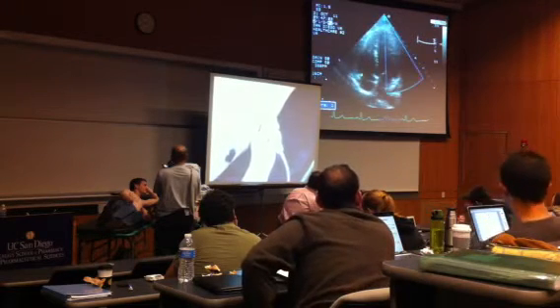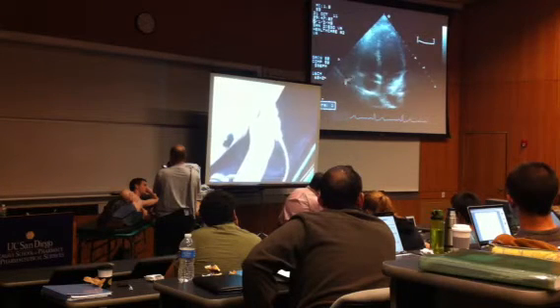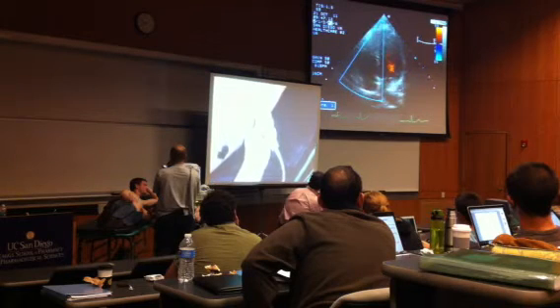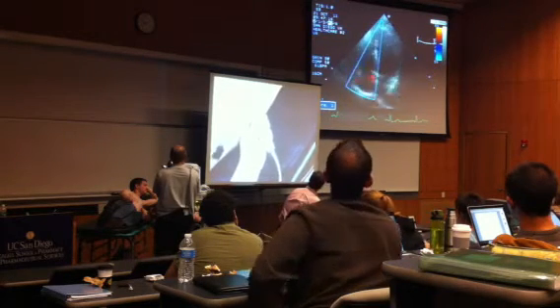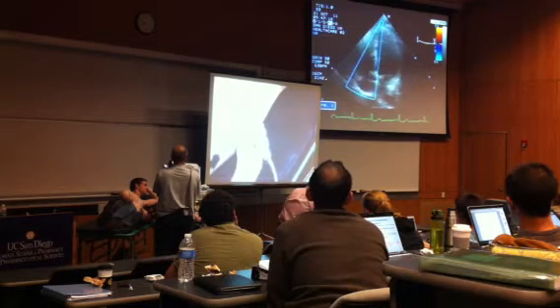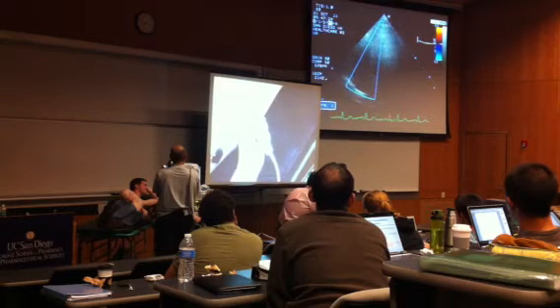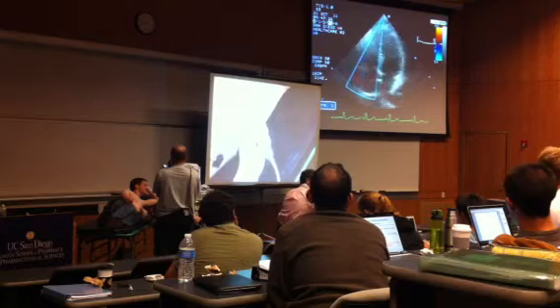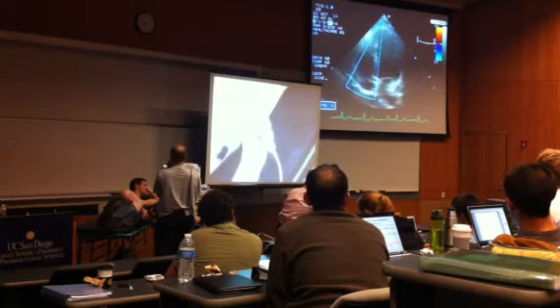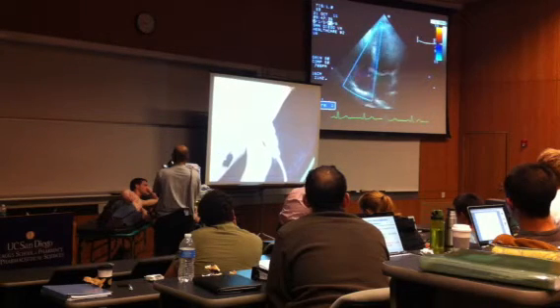So we're seeing the valves open and close. We're going to see if our subject, Evan, has any leakage across that tricuspid valve. As we said, there's a high percentage of people that do. No. All right, but he doesn't. So in that particular case, we would not be able to use that Bernoulli equation to calculate pressures inside the heart. Many people we do have some. There may be the tiniest flick of it. Let's see if we can capture some.